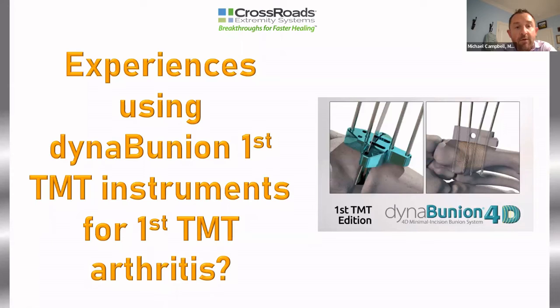So pretty straightforward. Yeah, I think the hardest thing for me on these is if you go medial with it and you put your medial rack block on, if you want to use the medially based plate, you have to pin it. So if you're a person that likes to leave the rack block on and put your plate on, you might struggle if you're on the medial side, if you have a second incision over the dorsal aspect.